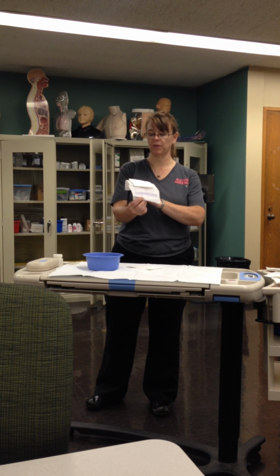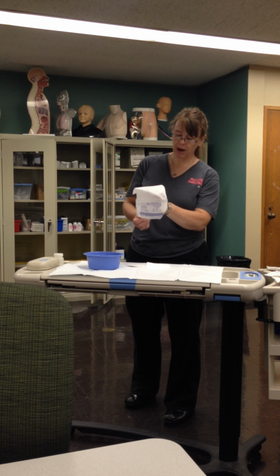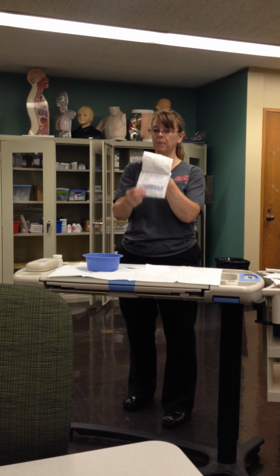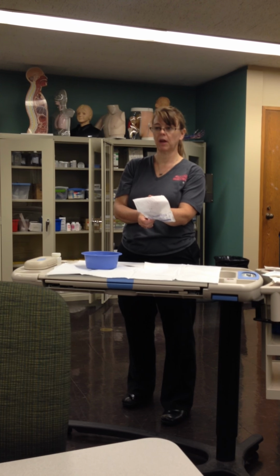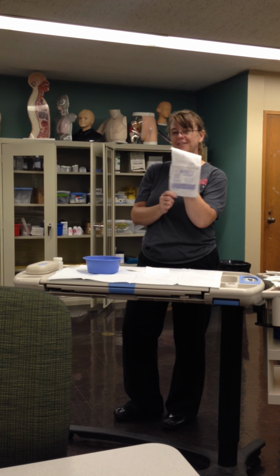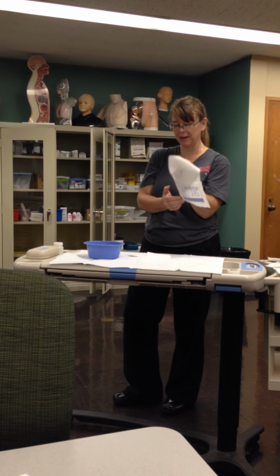This one's been open, so that's why it's falling apart a little bit. And then I'm reaching out. Now, I'm reaching out, but see how the sterile part of my hand is over my... You guys are shaking your heads, so I'm going to go with you understand what I'm trying to say. This is blocking any... Sterile's over sterile. Yeah, sterile over sterile, so this is blocking any.